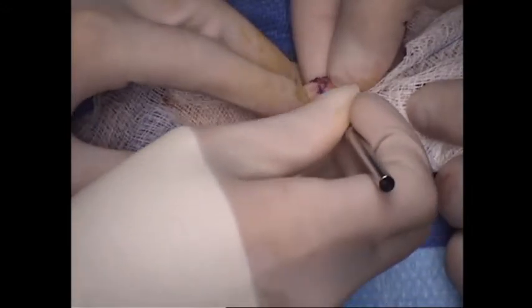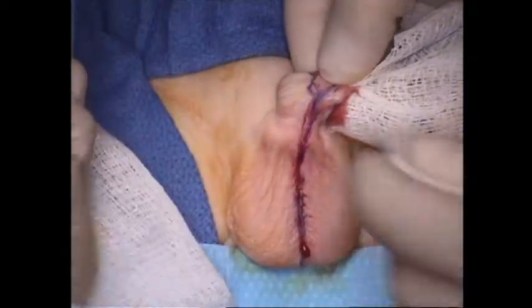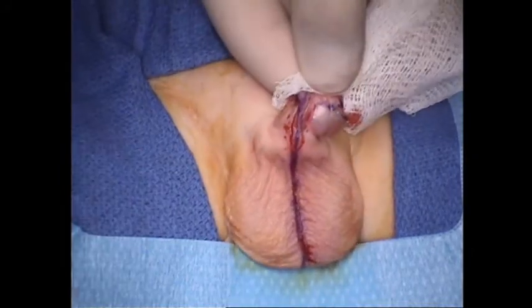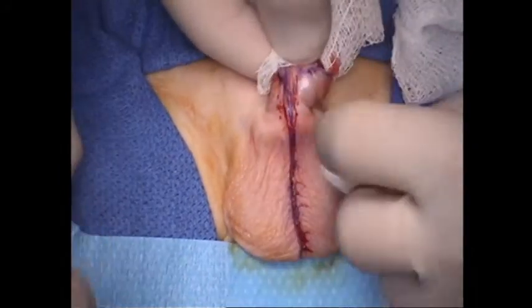And some urologists have been convinced that it's not always possible to accomplish both goals with the foreskin, but in fact, our experience has shown that it clearly is in essentially all cases. So we'll be emphasizing those steps in this video.